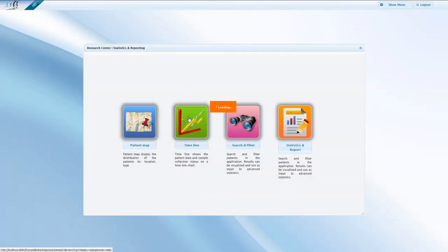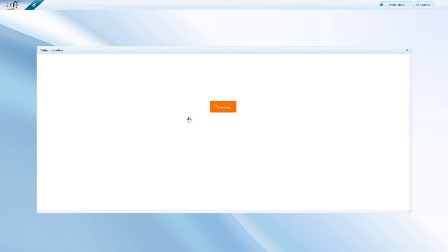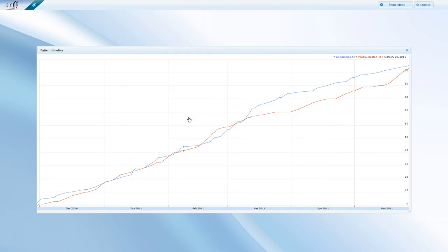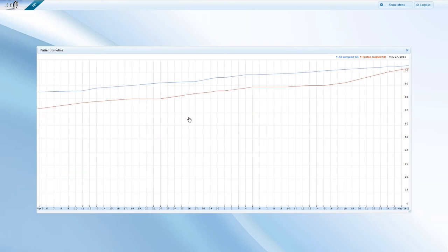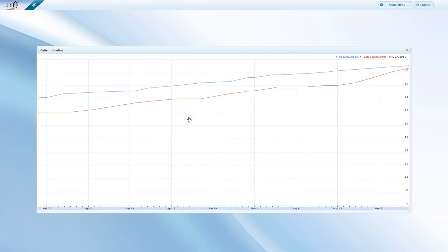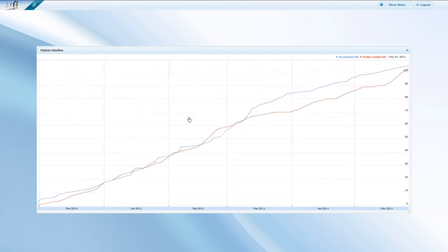The timeline shows when the samples have been taken and when the corresponding records have been entered into SmartBank. Although on this demo, time is displayed in months, you can zoom in to shorten the displayed period to weeks or even days.